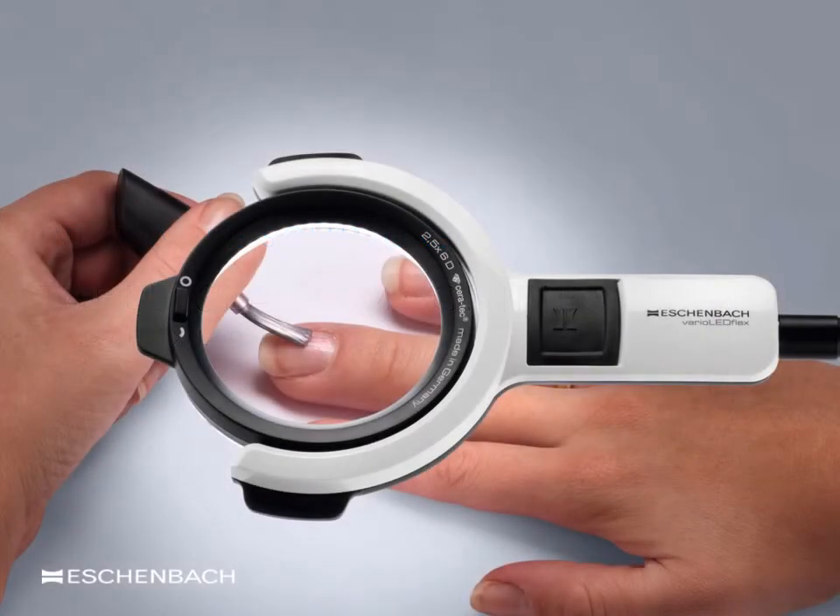The user may wear either their distance or near correction, and like the suspended chest-supported magnifier, the user will adjust the position of their hands beneath the magnifier to achieve the correct point of focus. If reading glasses are used, the hands, text, or object will be in focus closer in towards the lens than if they were wearing their distance correction.